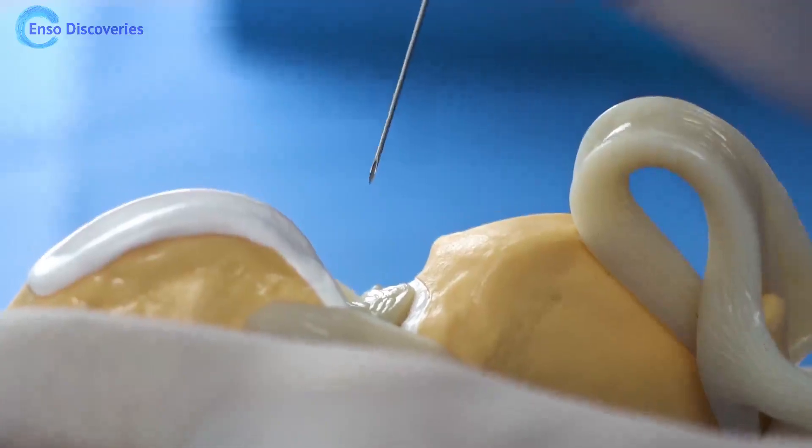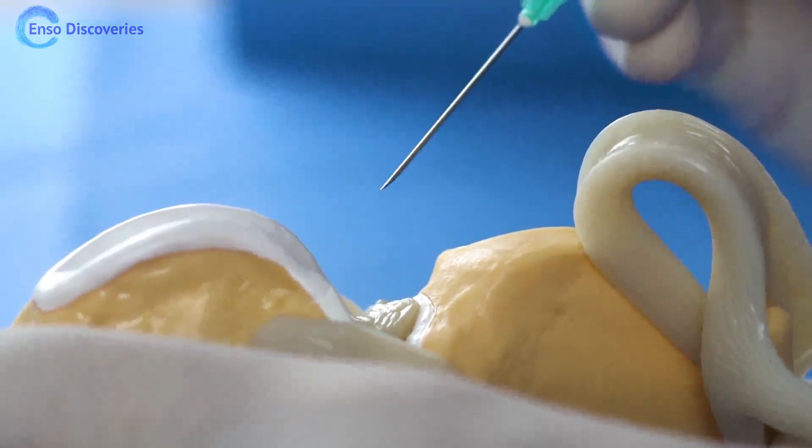Insert the needle perpendicular through the skin, then angle proximally and slightly towards the midline.